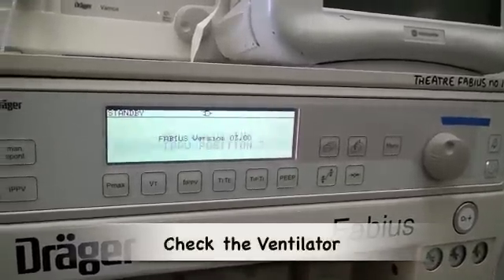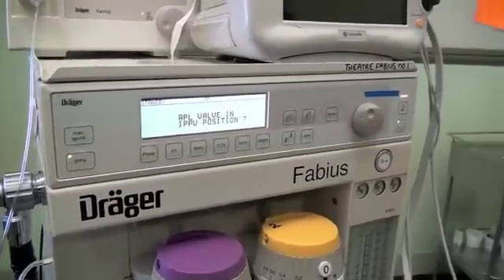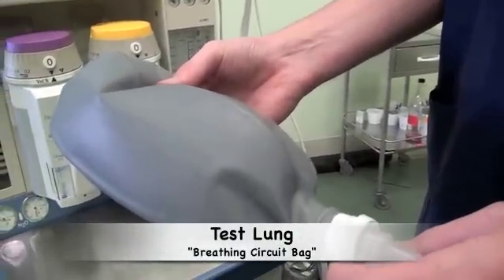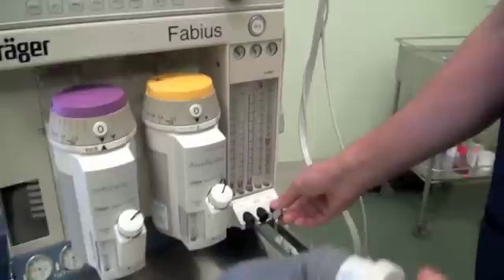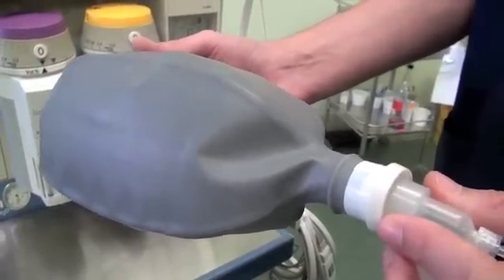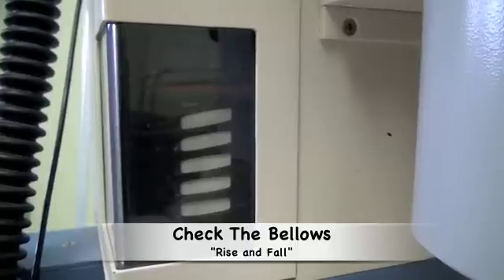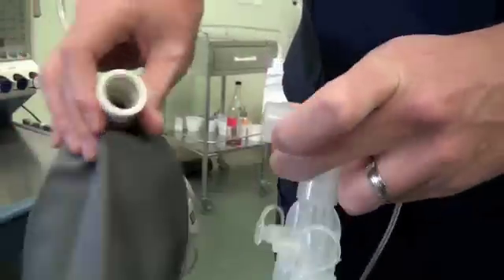The final test of the anaesthetic machine is to check that you can actually ventilate. This is done by selecting positive pressure ventilation mode, ensuring the APL valve is in the correct position, dialing in a fresh gas flow rate, and connecting a test lung — simply another bag — to the patient's end of the breathing circuit. Adjust the fresh gas flow rate to very low levels. If the ventilator continues to work and the bag continues to inflate and deflate, there are no leaks and the system is working. Watch and assess the movement of the bellows to ensure the bag is seated correctly and there are no leaks. If there is a leak, the bellows will be empty and won't refill.